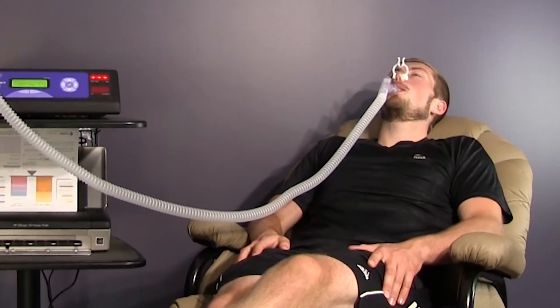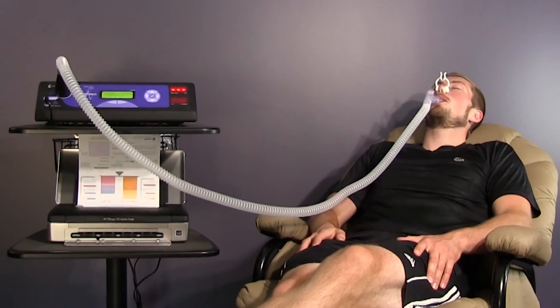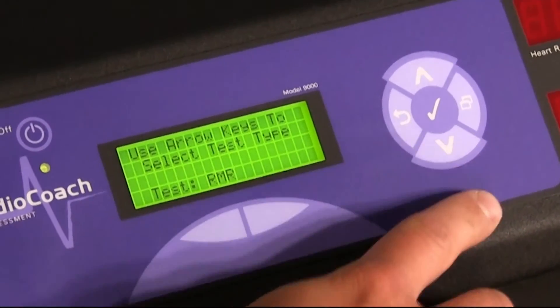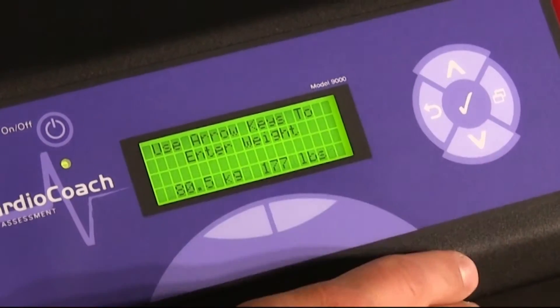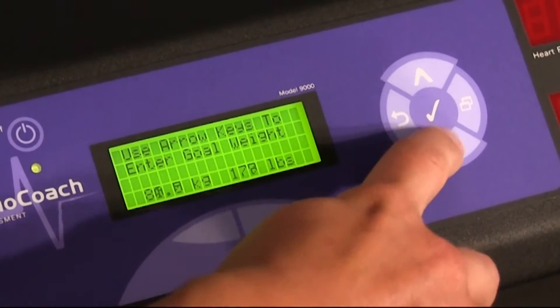If you own the CardioCoach Plus, you will have the ability to perform a resting metabolic rate test on your machine. To begin a test, you will select RMR as your test type. Enter in all requested information including your client's age, height, weight, and gender using the arrow and selection keys.